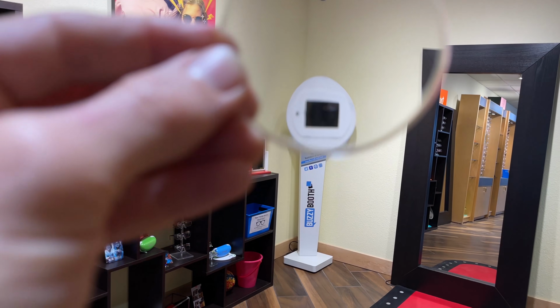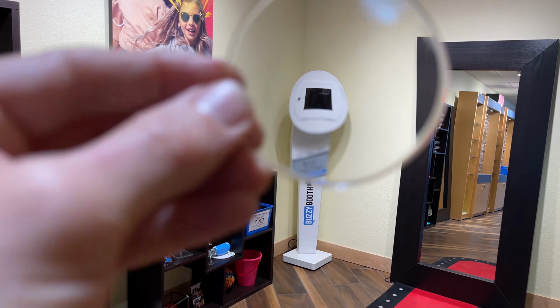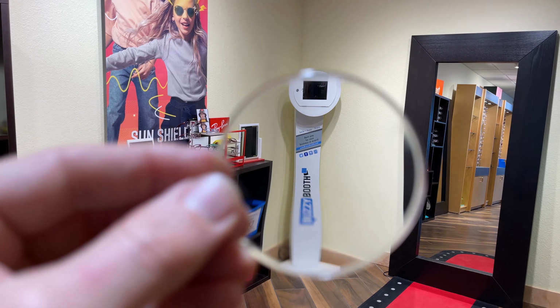I personally don't like it when people use their neck a whole bunch to go up and down, because that can lead to neck and shoulder issues. But early on, just trying to get used to them, trying to find where that power is, where things look good, I think that's fine, especially just, again, trying to figure it out. But again, the important thing to understand is that the power's at the bottom, so you need to look through the bottom of the lens.